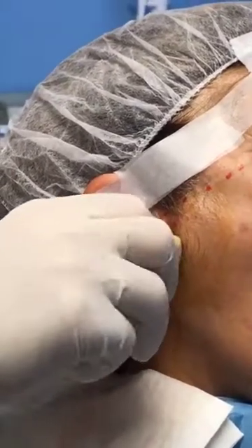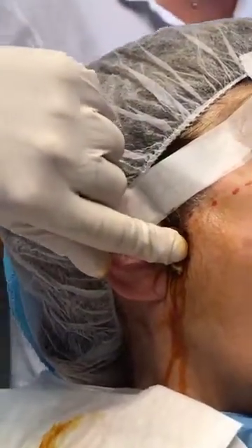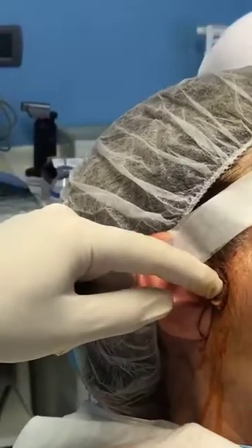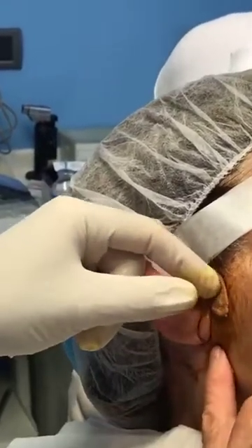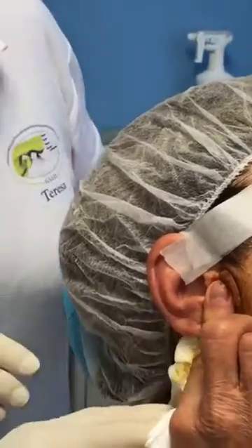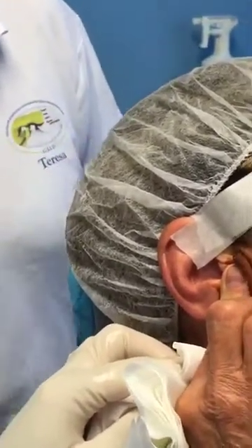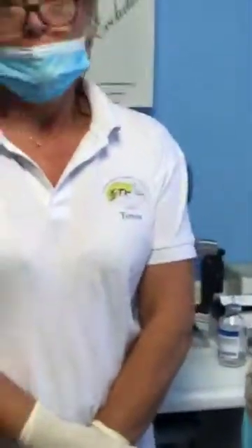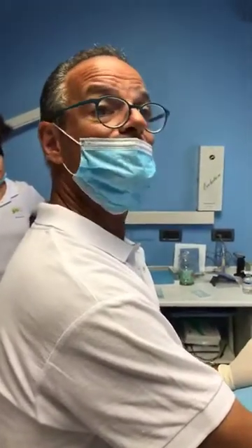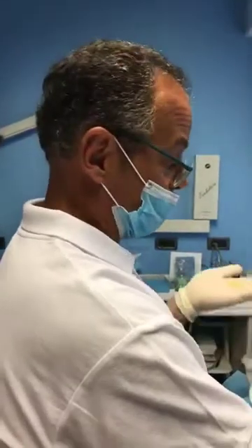And here we are. Very easy. It's important that you keep the mouth open for a couple of minutes — just to let the fluid, the hyaluronic acid, spread inside the joint. And then you can close.